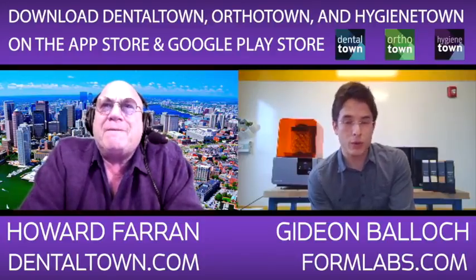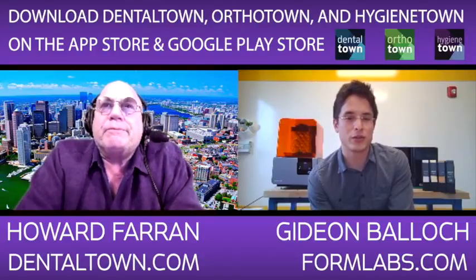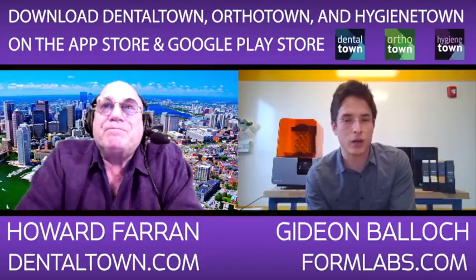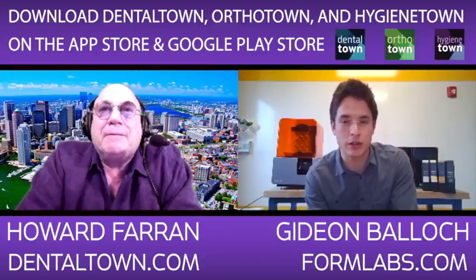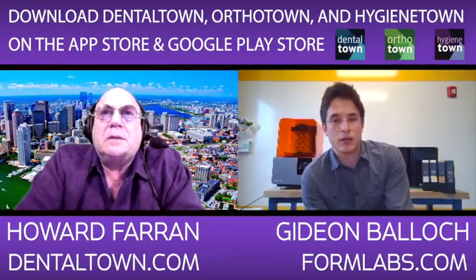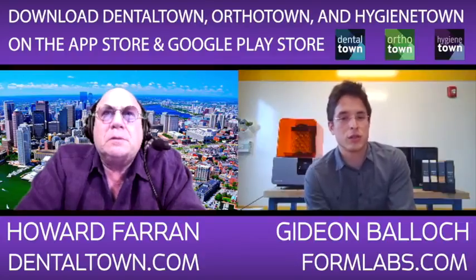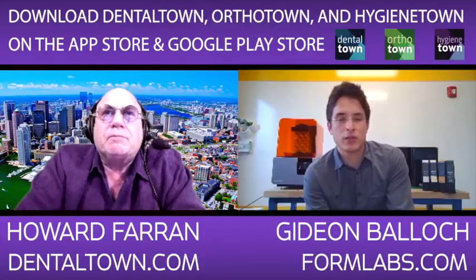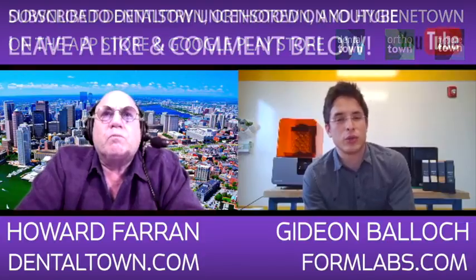Do you think someday the printer will print with gold or heavy metals or anything like that? Well, actually, there are metal 3D printers out there. They don't print in gold; they print in other metals. And if you're a large, giant lab like Glidewell or Argen or one of the big ones like that, you probably do have what's called a direct metal laser sintering (DMLS) printer. They are printing copings, things for PFM crowns, partial frameworks, that sort of thing. So that is possible. Those machines cost such an exorbitant amount that it's really not an accessible technology.